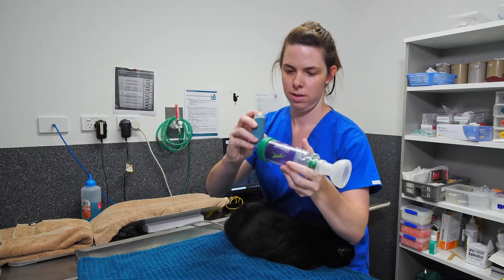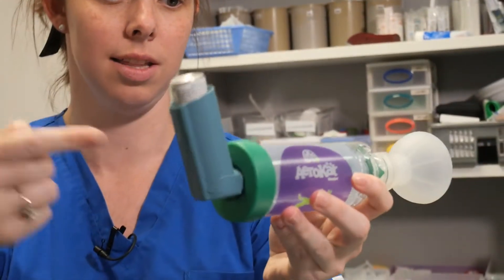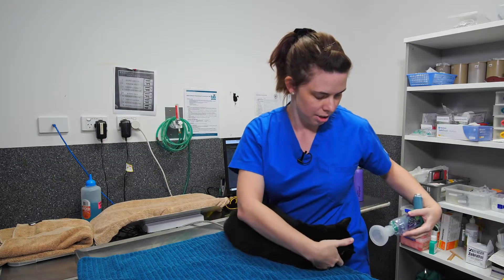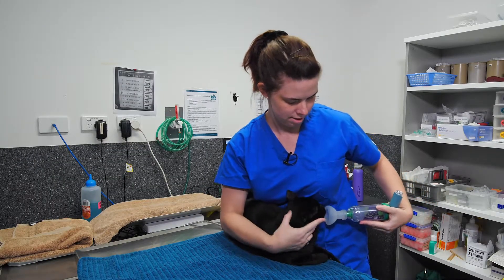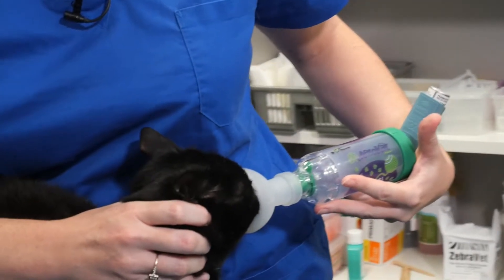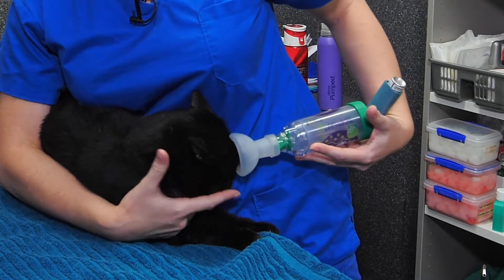From here, push down on the inhaler and that will release the medication into the chamber. Then put the chamber up to their face. Generally cats will sit here pretty well.